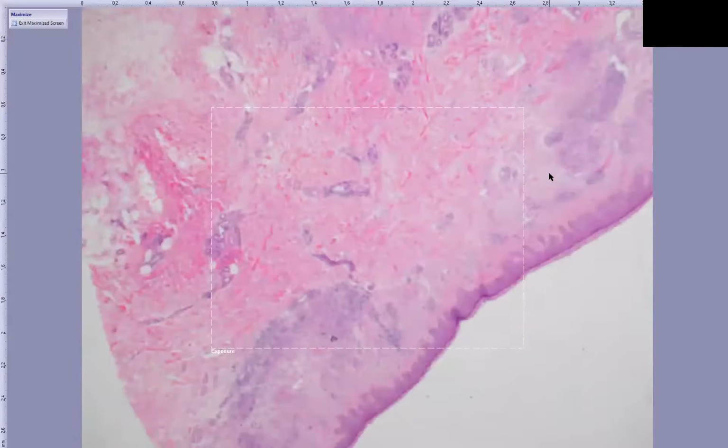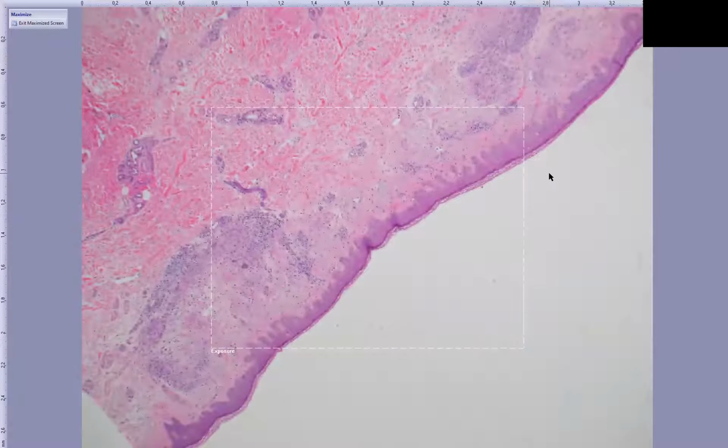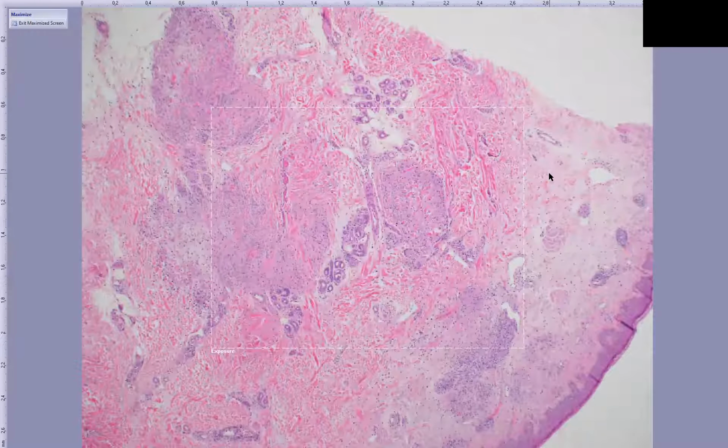The third contrast that I want to chat about is granuloma annulare versus necrobiosis lipoidica. So we just covered necrobiosis lipoidica. And let's take a look at granuloma annulare. So in granuloma annulare, you have complete and incomplete palisade. So you have ring-shaped structures. They may not be perfectly ring-shaped. You can have incomplete ones that are just arciform, or they just might be half of an arc.